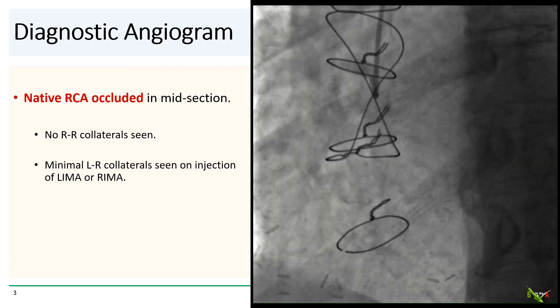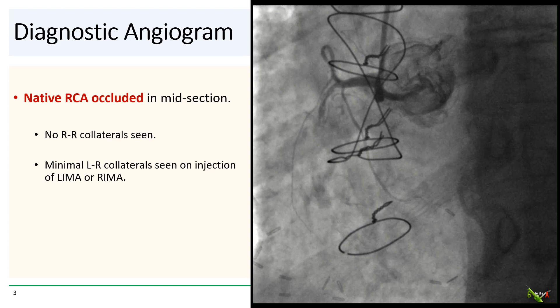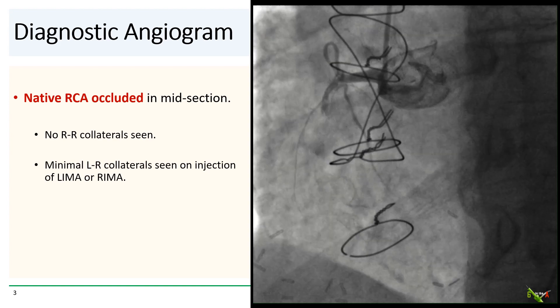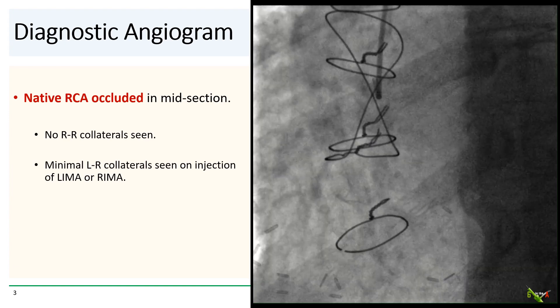Here is his RCA, which is occluded in its midsection. There are no right-to-right collaterals of any significance, and the left-to-right collaterals injected from the LIMA and the RIMA were also minimal.